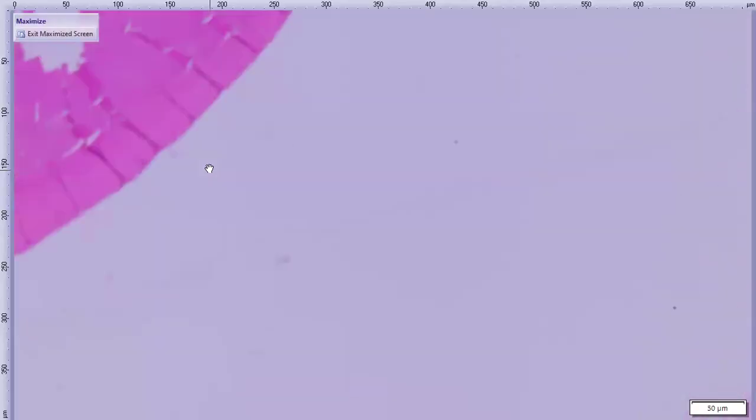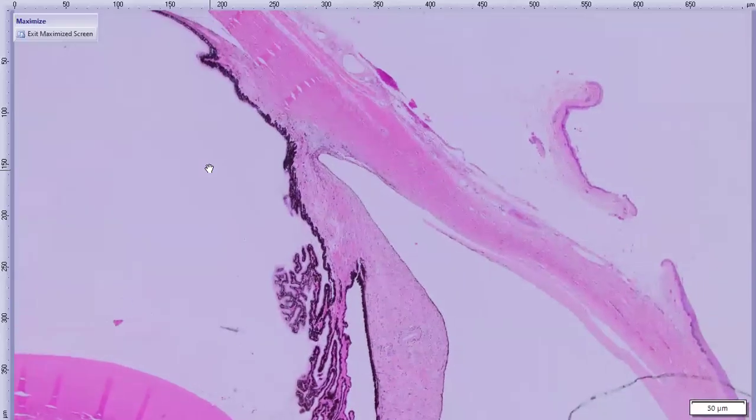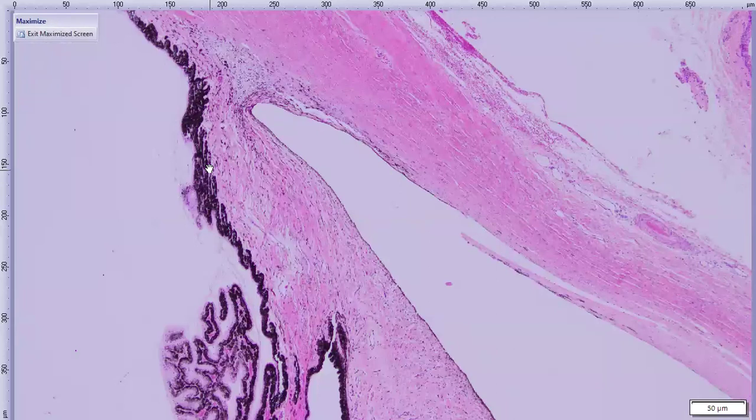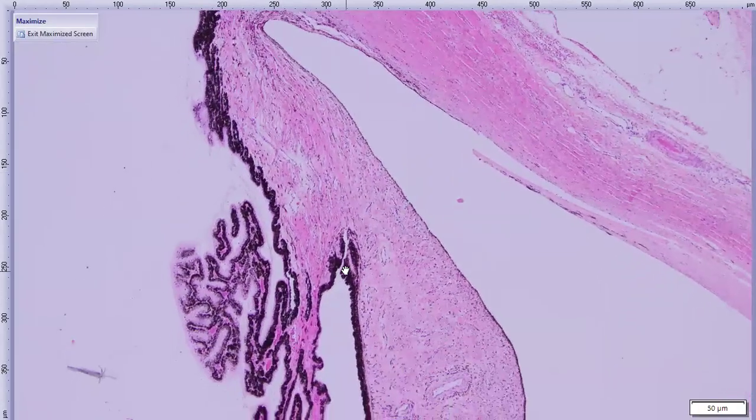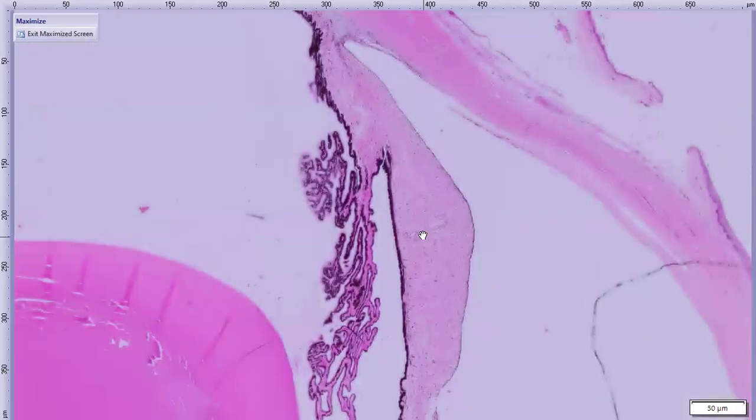It's less severe on this side, but still pretty distorted. Basically a really deep anterior chamber here with posterior displacement of the iris base, and the ciliary body itself is displaced from where it usually would be, to the point that it looks like the ciliary body plicae are coming out of the iris. So that's what we're looking at up front.